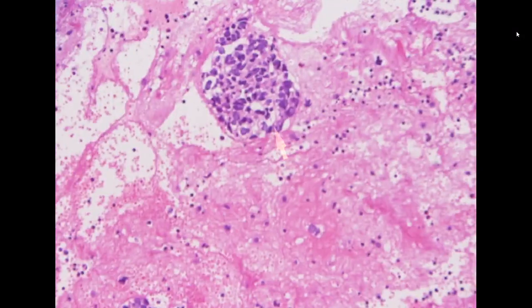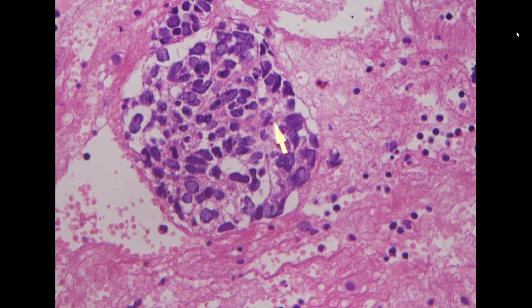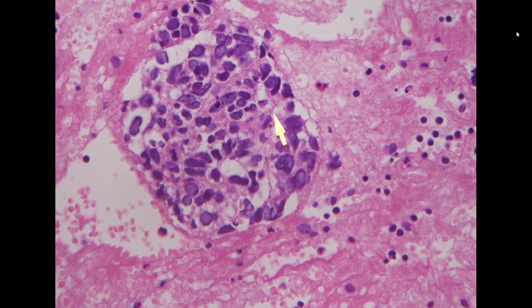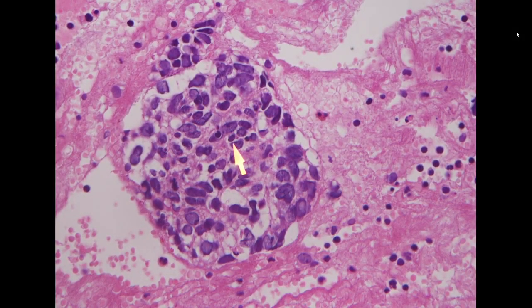In some of the area, the cell morphology is actually intermediate between non-small cell and small cell, because you see quite a lot of cytoplasm here, but the chromatin pattern is still more compatible with salt and pepper pattern.